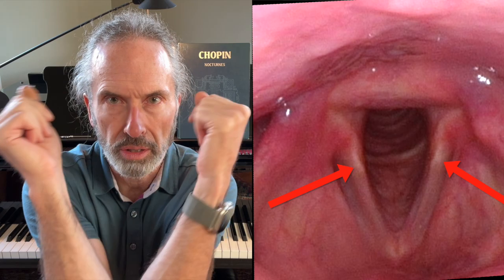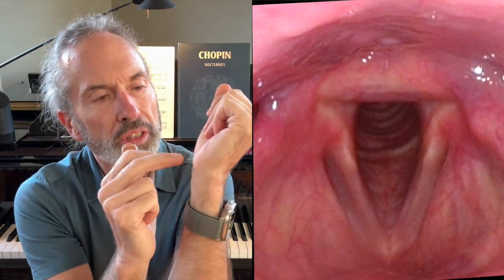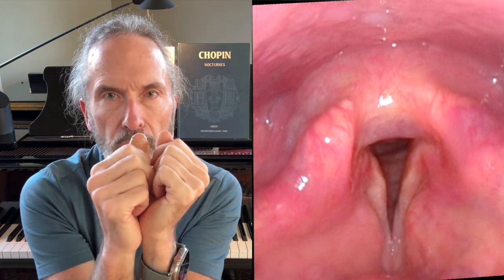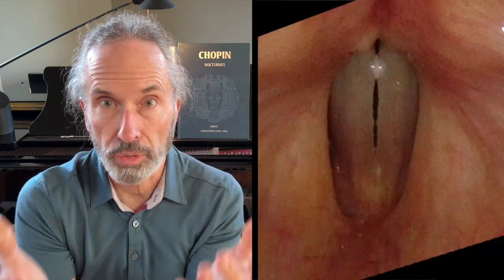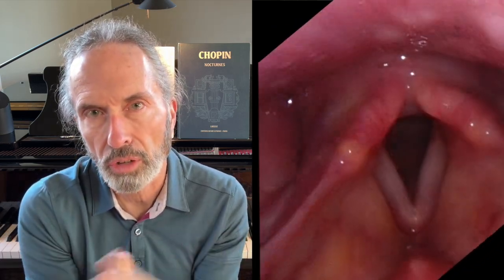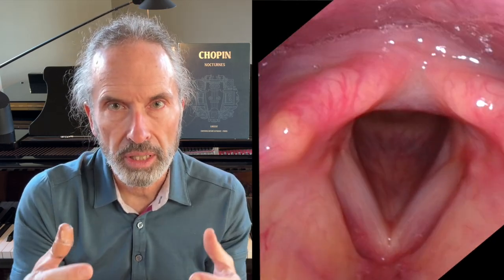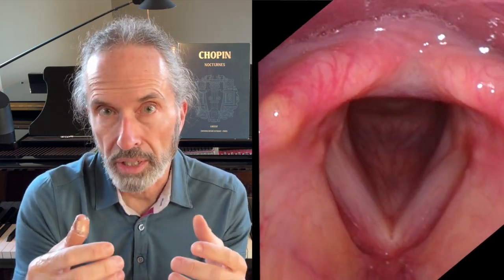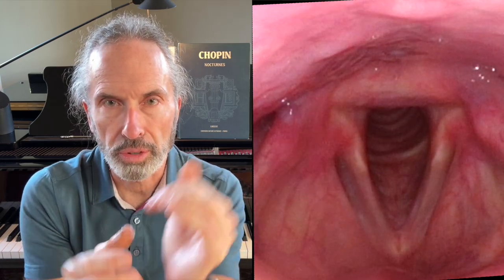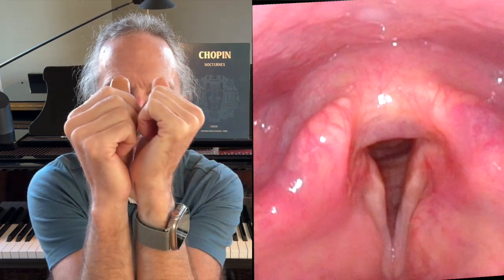And if I use my arms here as the vocal cords, the V shape of the vocal cords, the vocal process is going to be my wrist. And we can watch two things. We can watch phonation on stroboscopy, and we can watch breathing, and breathing is often missed. So when you're recording with your endoscope and you want to see what the lateral cricoarytenoid muscle is doing, train your eye on the vocal process, and we'll look at a bunch of normals.